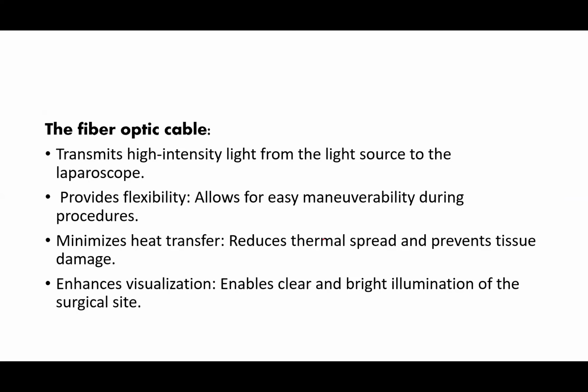Now, the fiber optic cable transmits high intensity light from the light source to the laparoscope. It provides flexibility and allows for easy maneuverability during the procedure. It minimizes heat transfer. It has a form of heat absorbent property that reduces thermal spread and prevents tissue damage.